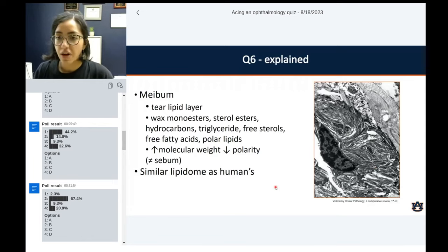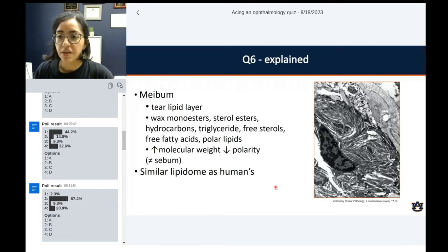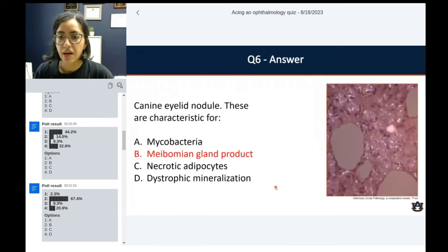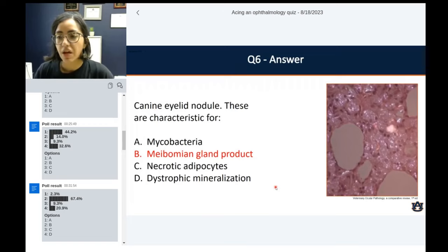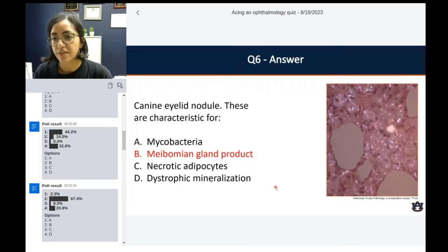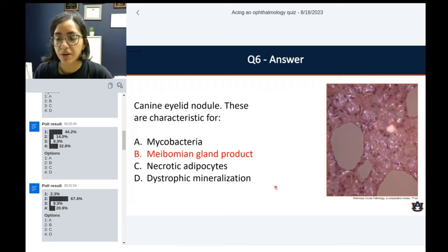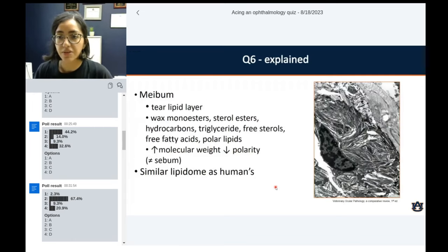The polarization does not happen in sebaceous glands — no rupture in those tumors. So we can see these polarized structures in meibomian gland adenomas when they rupture, epitheliomas that have a little bit more meibom secretion, or the regular chalazions or lipogranulomatous blepharitis — just solitary rupture of those glands. If you polarize it, you know you are in the meibomian gland category.